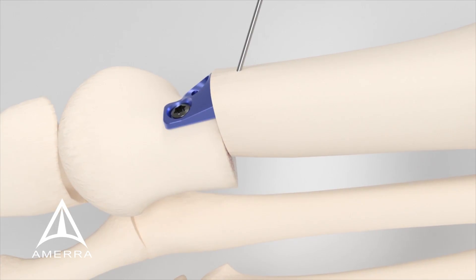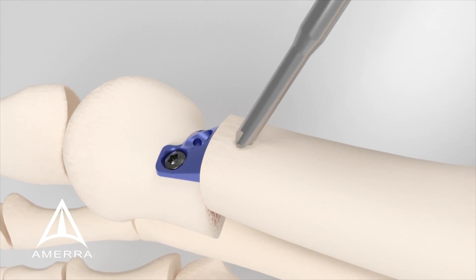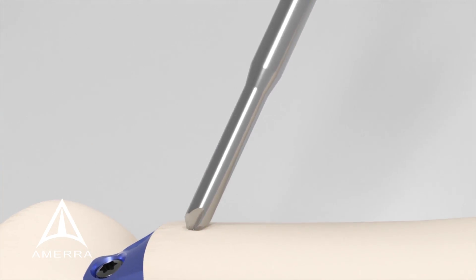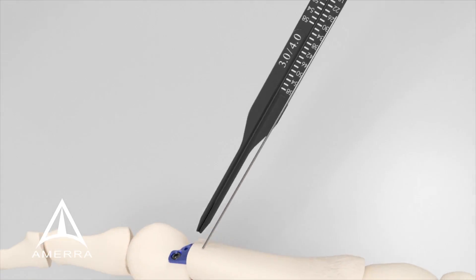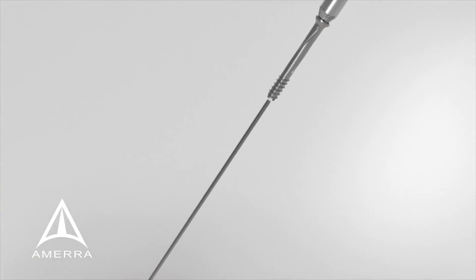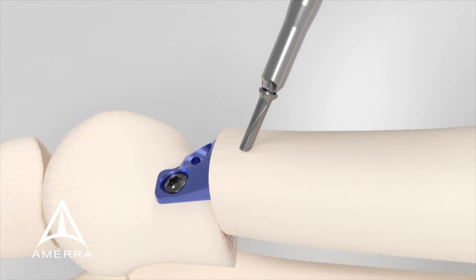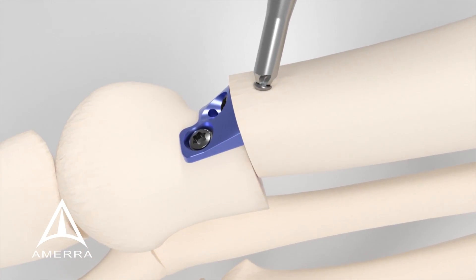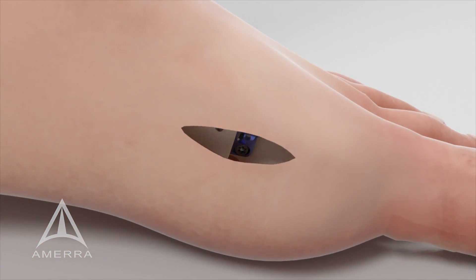Optionally, a cannulated screw may be utilized here instead. Slide the countersink over the remaining K wire until the tip contacts bone and rotate it back and forth to create the necessary recess. Measure for the necessary screw length by examining the end of the K wire in relation to the marks on the cannulated depth gauge. Slide the appropriate length cannulated screw over the K wire and insert the screw using the cannulated driver bit until desired compression is achieved. Remove and discard the K wire, then close the surgical site per standard surgical technique.